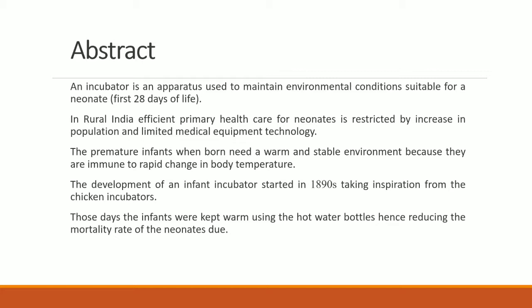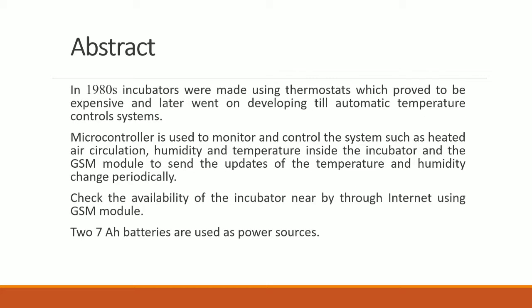The development of the infant incubator started in the 1890s, taking inspiration from chicken incubators. Nearly half of the infant mortality was reduced at this time. They were using hot bottles that needed to be replaced every 3 hours, so several infants could be kept warm in this incubator. Next slide. In the 1980s, incubators were made using thermostats, which proved to be expensive. Later they went on developing till the automatic temperature control system.